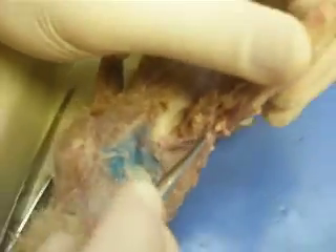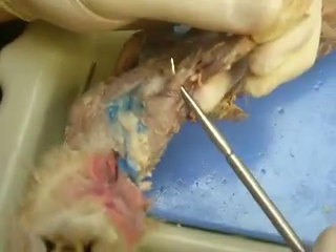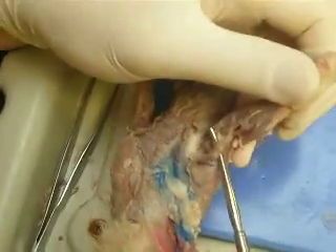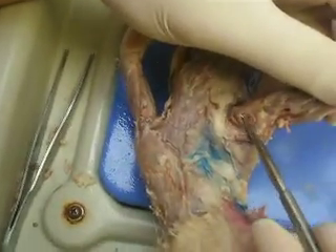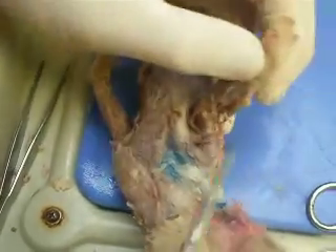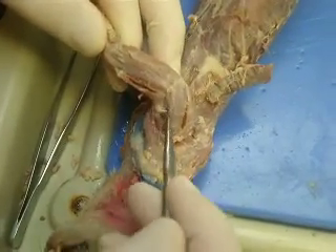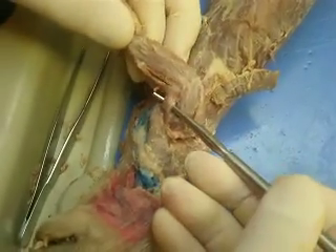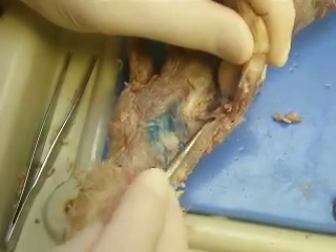Up here, underneath here, you have biceps brachii on top of the probe. Here you have tensor fascia antebrachii, this thin muscle right here. On the outside, you have brachialis. The biceps and the brachialis are separated by this muscle right here.